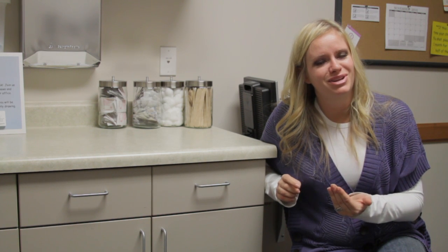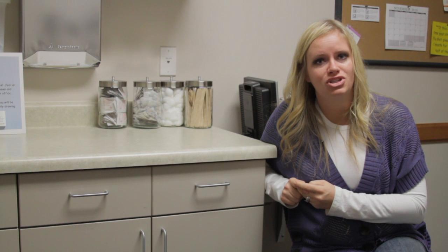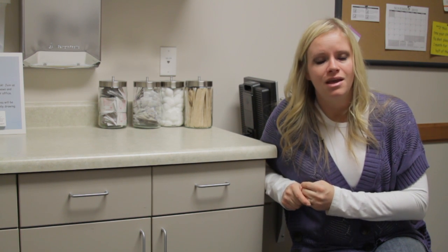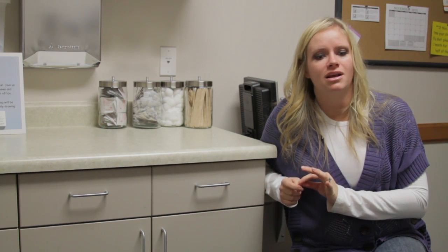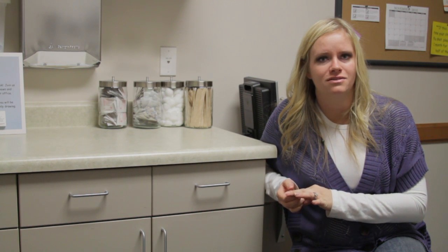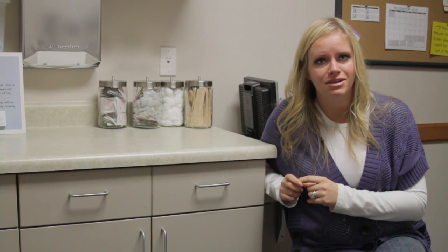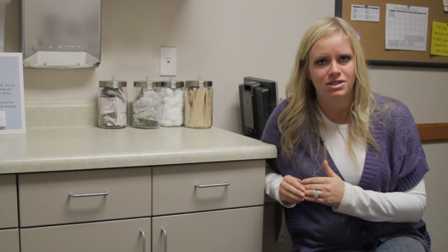But it's also important to make sure that you know that your string is there and that your IUD is in a good place. Usually we recommend checking your strings every month. The Mirena IUD string I describe as feeling like a guitar string, and the Paragard IUD string feels kind of like fishing line. A lot of times the strings will just wrap around the cervix over time, so they are a little bit more difficult to find.